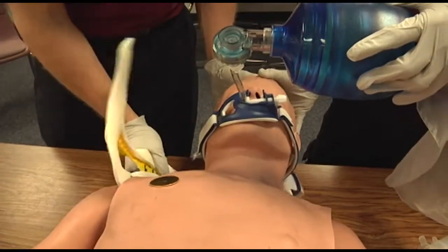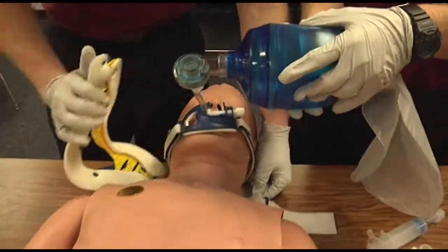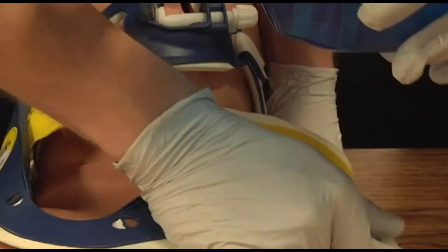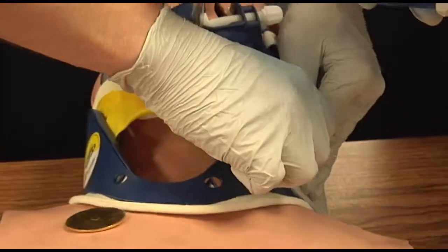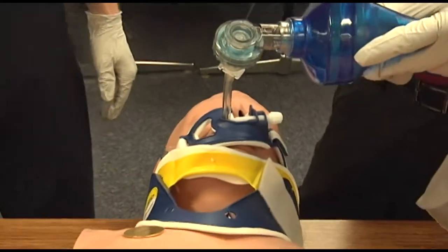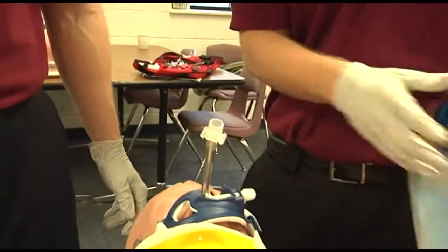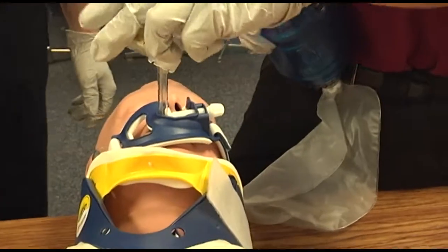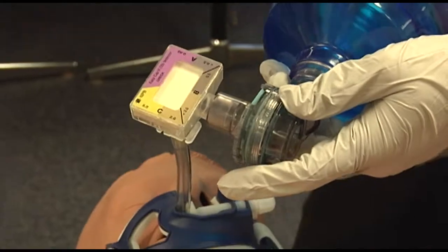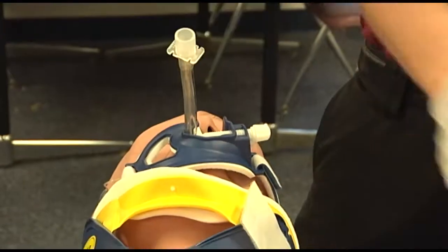A C-collar may be placed at this time. All methods of verifying tube placement should be used — including capnography, end-tidal CO2 monitoring, and a colorimetric device. The colorimetric device will turn yellow or gold if CO2 is detected. The esophageal detection syringe is another verification method.